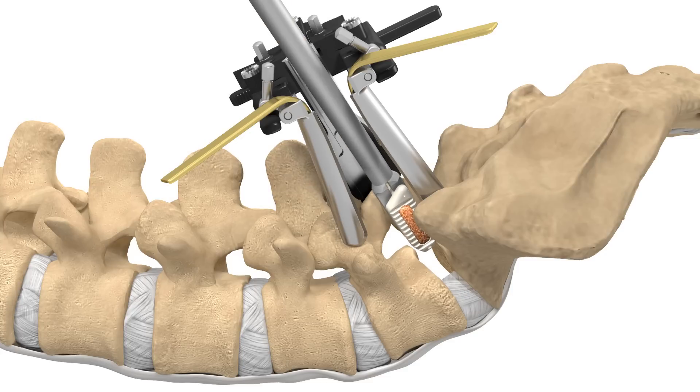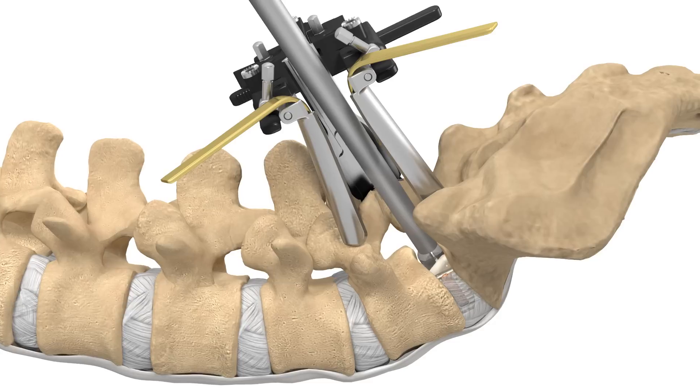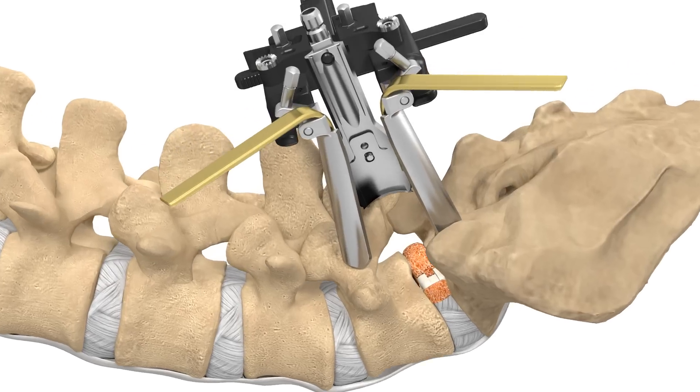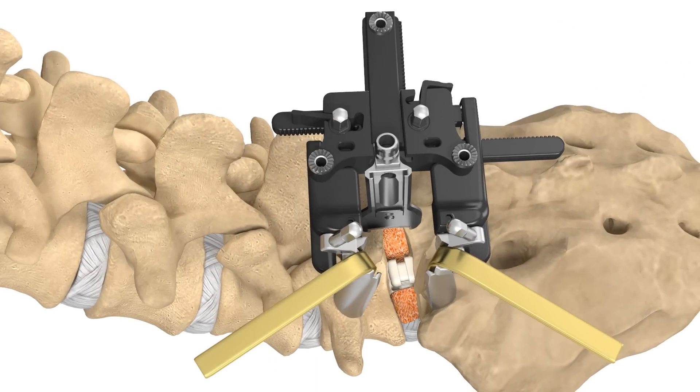An appropriate implant will be chosen by your surgeon. The implant, along with bone graft, will be placed into the empty disc space to restore the proper disc height and assist in spinal load, alignment, and fusion.